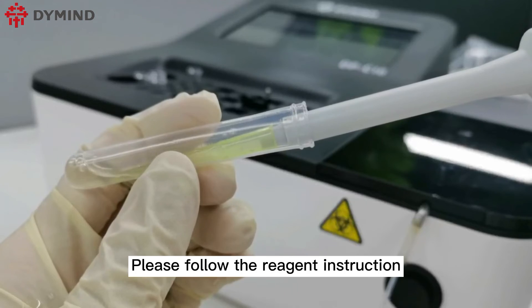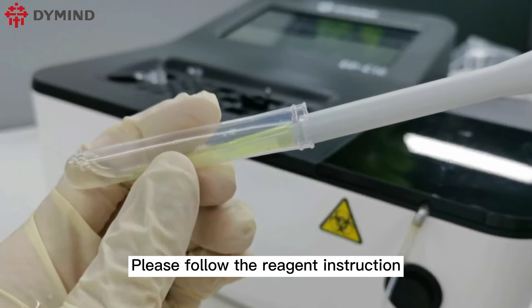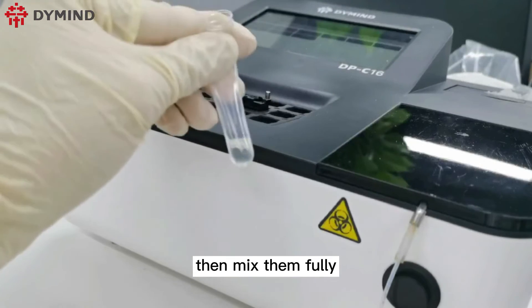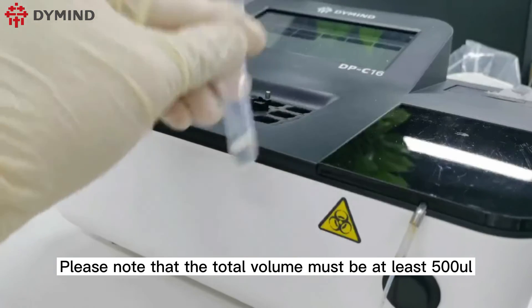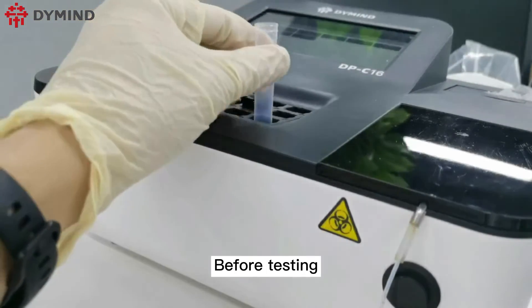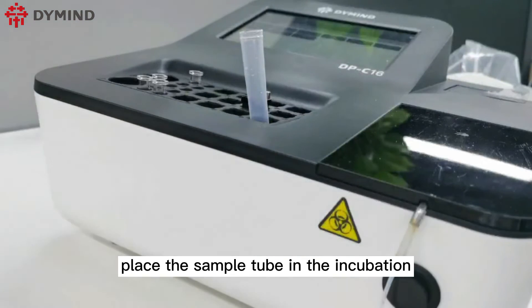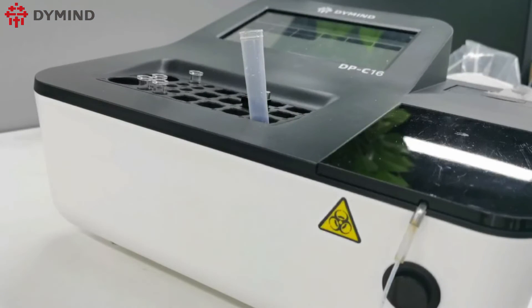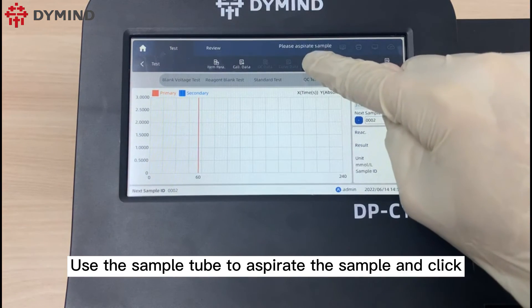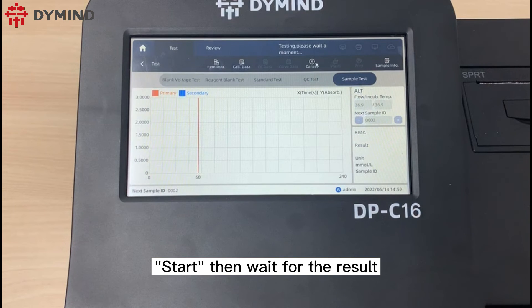Click sample test. Please follow the reagent instruction and put the reagent into the sample tube, then mix them fully. Please note that the total volume must be at least 500 microliters. Before testing, place the sample tube in the incubation bath for half a minute. Use the sample tube to aspirate the sample and click start, then wait for the result.